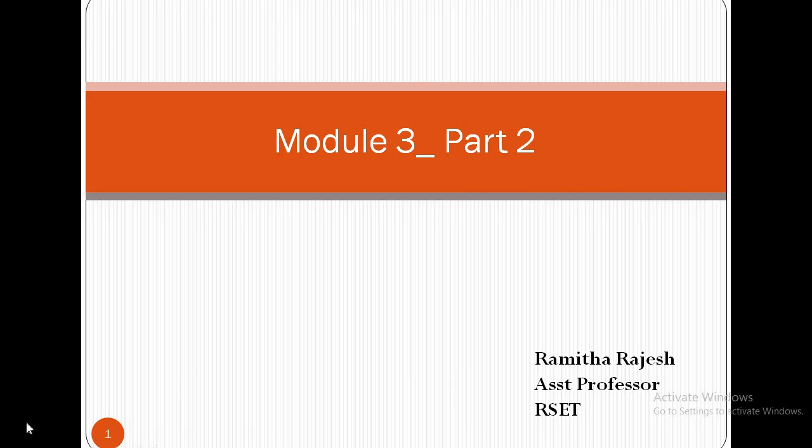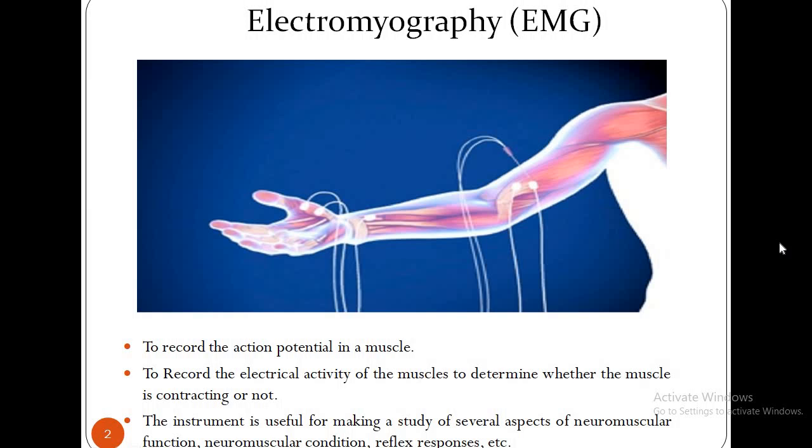Good morning. This is part 2 of module 3. Electromyography or EMG.